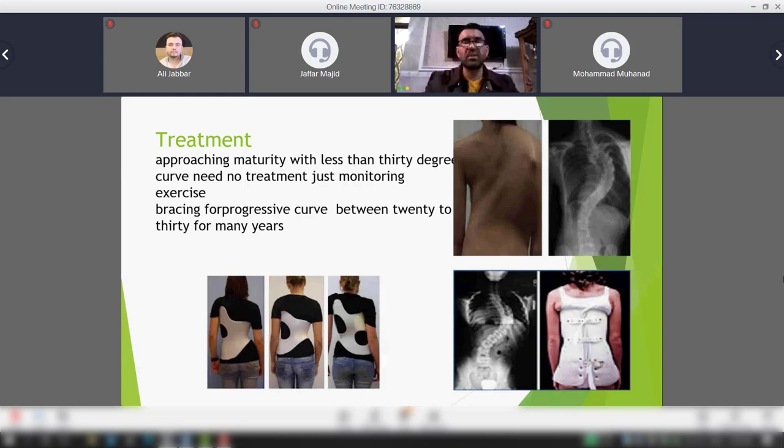الكوبس انجل is important for the treatment. ليش؟ لانه هنا يحدد لنا the degree of curvature، ايش قد زاويه الكيرفيتشر. نسأل سؤال، الزاويه مالته طلعت عندنا 30 درجه فما فوق، لو 30 درجه فما دون؟ 30 درجه فما فوق معناته شنو؟ it needs intervention.